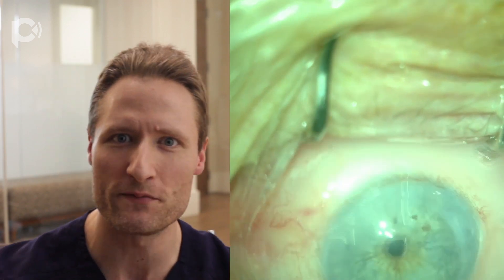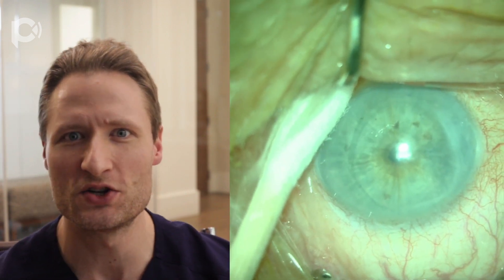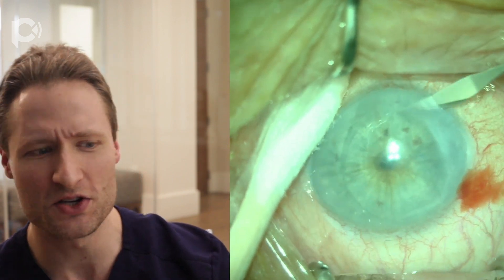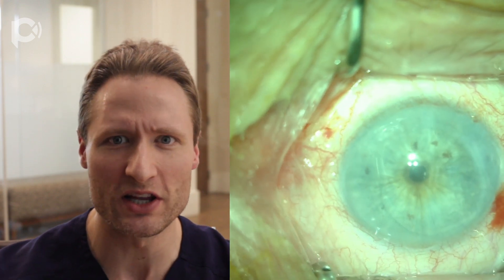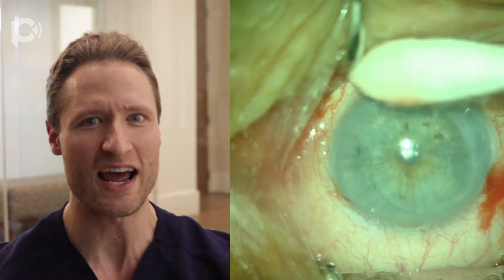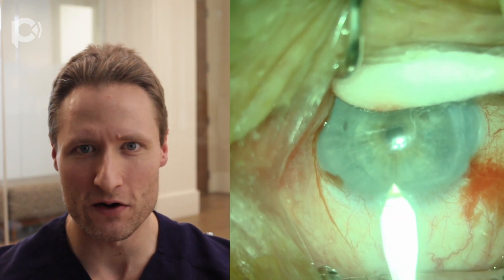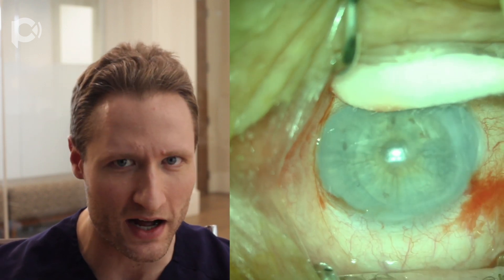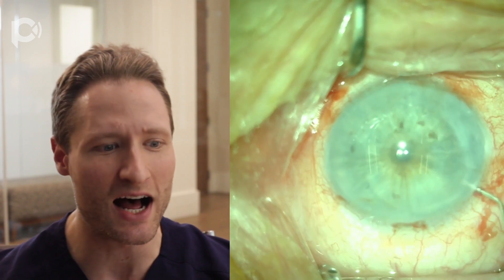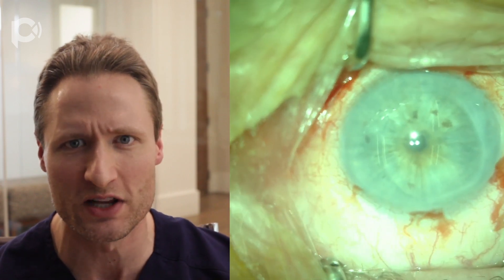The most notorious setup for that is an eye that is post-vitrectomy, but you may find many other situations in which the anterior chamber is unexpectedly deep. One such situation is in an eye of an elderly patient — this patient here on the operating room table is in their late 80s. In elderly people, the vitreous is syneretic and therefore nearly entirely liquefied and consequently provides minimal, if any, posterior support. So these eyes behave very much as though they have been vitrectomized.